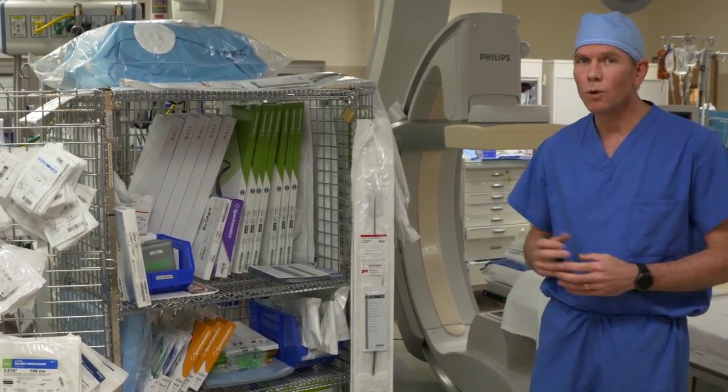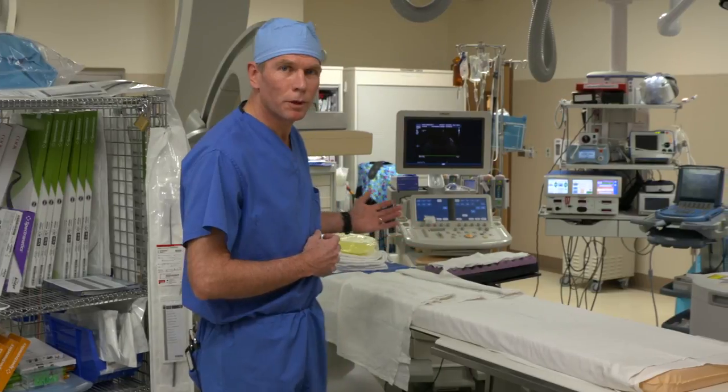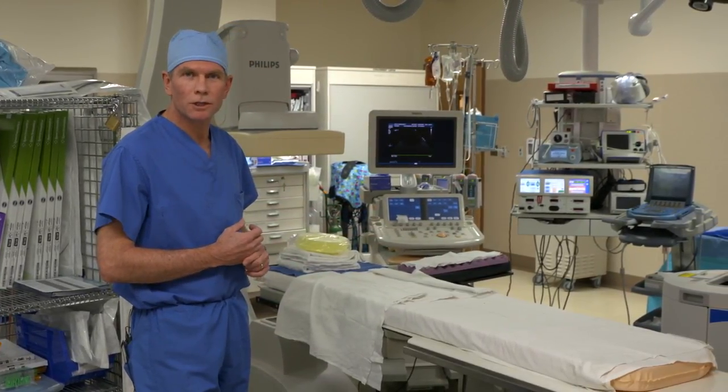In addition to all the equipment required, we also have high-definition fluoroscopy equipment, as you can see here, that enhances the visualization of the procedure.